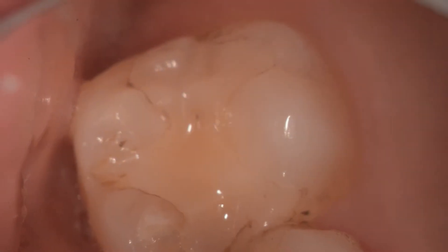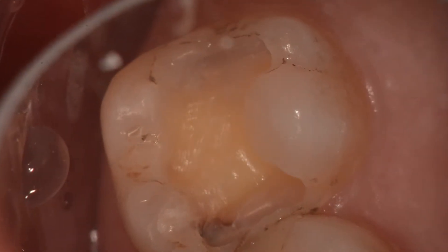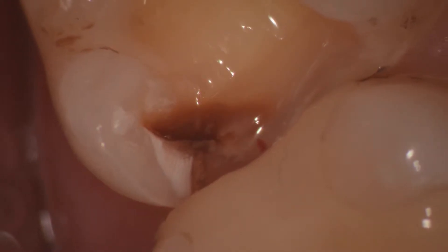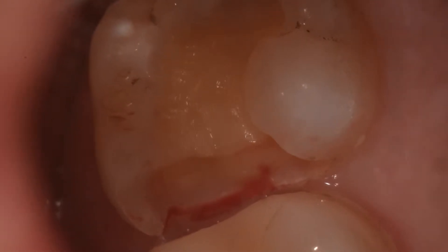We see here an upper second molar which has a composite MO restoration. When we remove it we can see decay on the buccal aspect of the box. Closer inspection reveals the decay is quite subgingival, and you can see here bleeding has started.